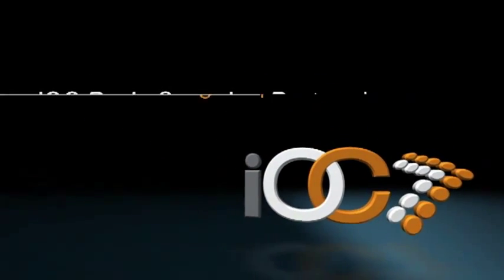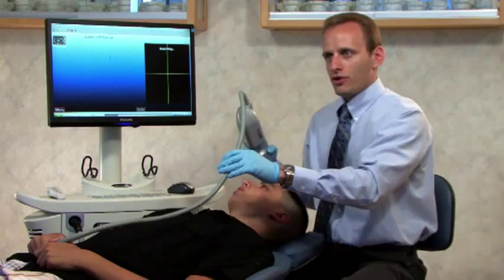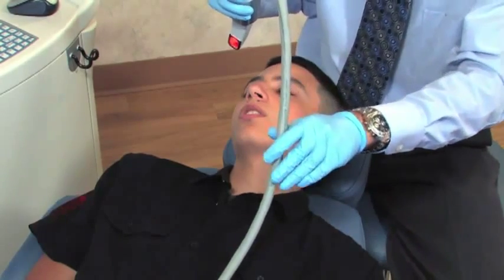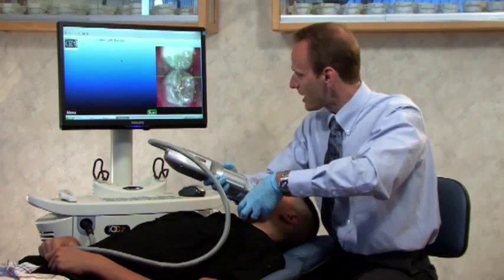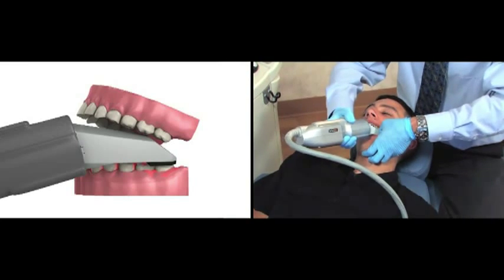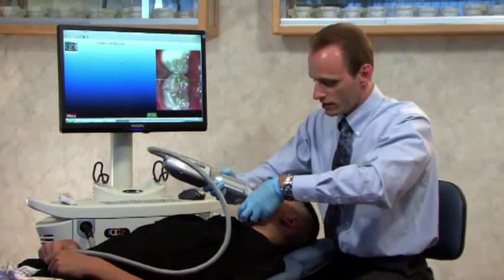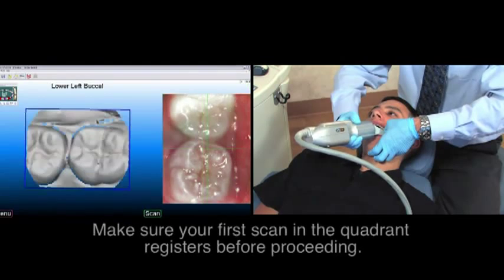Let's go through a basic scanning sequence step-by-step, beginning in the lower left quadrant. For comfort, I'll have the cord resting on the patient — the patient is actually holding onto the cord for me. I'll position the scanner over the lower left buccal, go to the most distal molar. To start, I'm going to give the system an occlusal view, and I'll press the green foot pedal to capture my first scan.